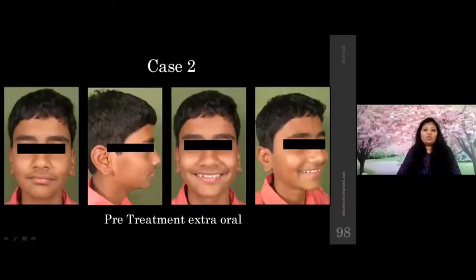This is case number 2, wherein the age of the patient was around 12 years. He came with convex profile, everted upper and lower lip, mentolabial sulcus deep, mentalis activity was hyper. You can check out his smile is non-consonant, and in profile view also you can make out the same, but you also notice that buccal corridor area here is negative.